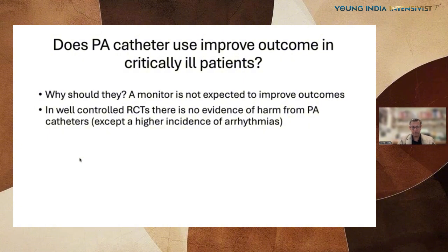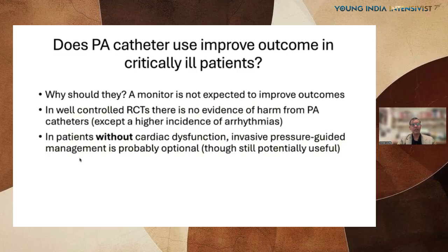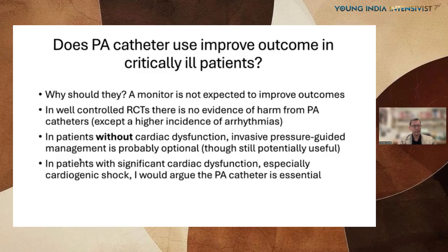If you ignore some of the waveform problems that I showed and you rupture their pulmonary artery, that is a user problem, not a PA problem. In patients without cardiac dysfunction, you're probably fine. It's the CVP. I'd argue the CVP is still useful, but the PA catheter is not necessary.